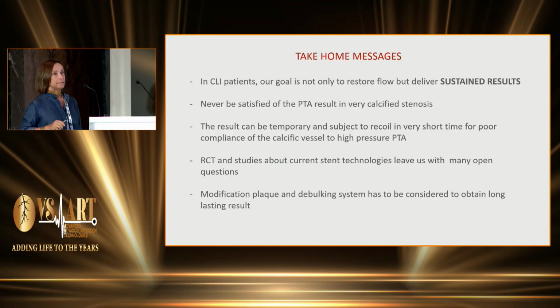So in the end, what we can say is that in chronic limb ischemia, the goal is not only to restore the flow, which is actually one of the most important goals, but also to deliver sustained results, something that can last longer than our procedure or just the day after. So never be satisfied with the result of our PTA. I learned it myself, because the result can be just temporary and subject to recoil in a very short time.